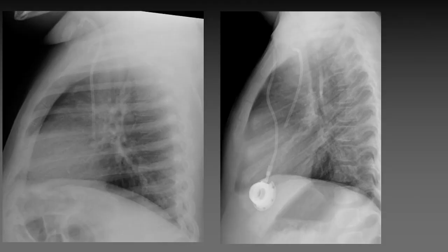The lateral chest x-ray can also be very helpful in identifying patients with an arterially misplaced venous catheter. The course of the SVC is straight on both frontal and lateral views, while the course of the ascending aorta curves more anteriorly.